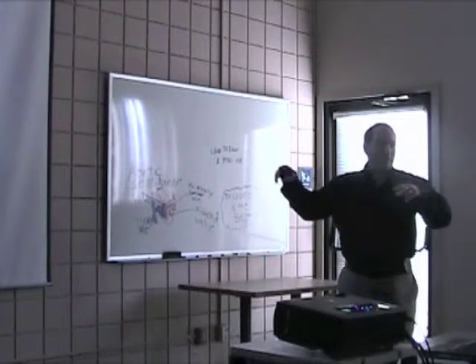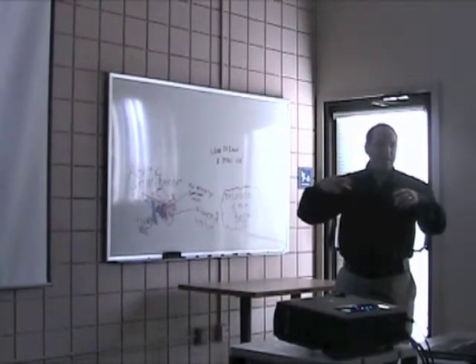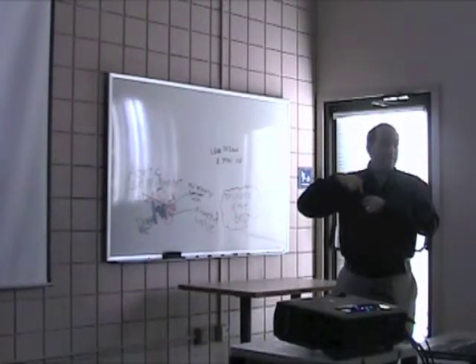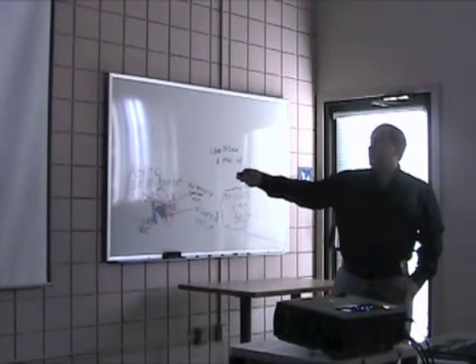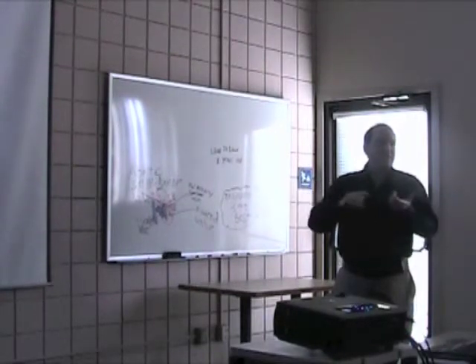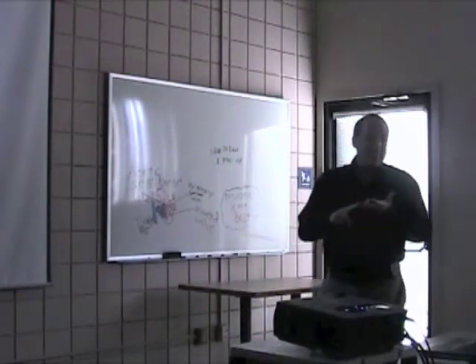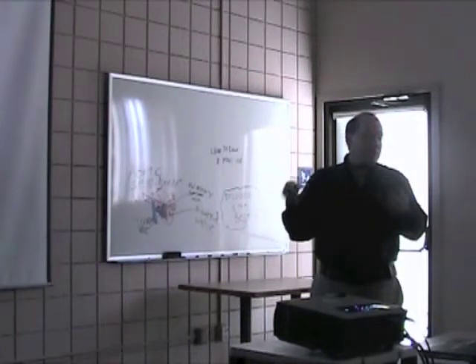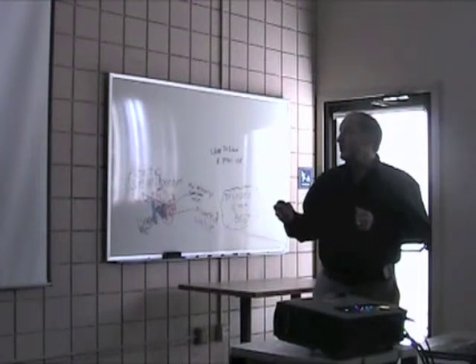The blood is going from the heart-lung machine up into the aortic arch, through the whole body, and then draining back into the heart-lung machine through the right atrium, through another cannula. So the heart has been isolated. That's what this is right here. This is draining all the blood from the patient back into the heart-lung machine. That allows us to oxygenate it, take the carbon dioxide out, and also adjust the temperature. Whenever we do these operations, we cool the patient down as well, because it decreases oxygen requirement for the brain and all the vital organs as well.